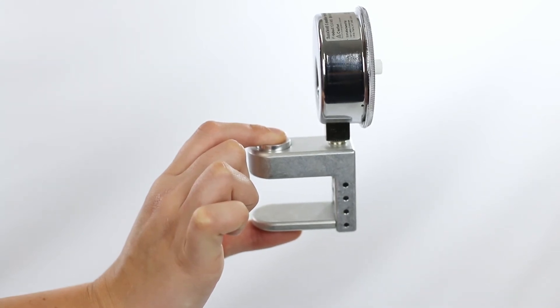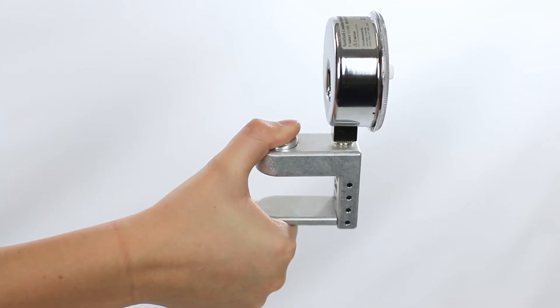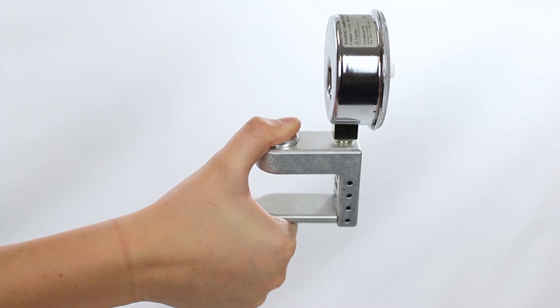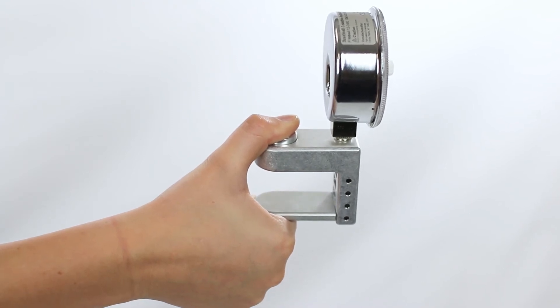Make sure the other fingers do not interfere. For the key test, the patient should have their palm facing inward. Have the patient pinch the gauge between the flex PIP joint of the index finger and thumb.